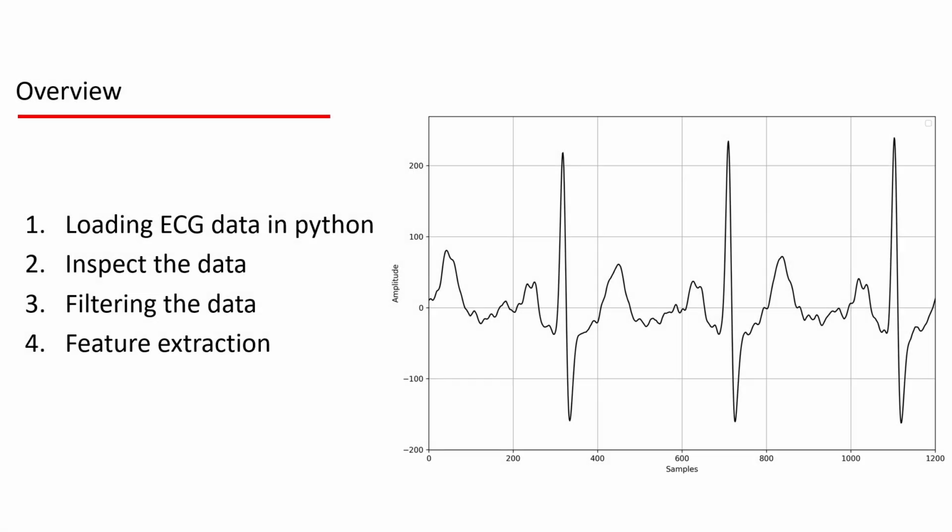Hey everyone, I've decided to create a short series of videos on ECG signal preprocessing in Python, because I feel like there aren't many resources on YouTube on this topic, so I kinda wanted to fill that gap myself. Over on the left, you can see an overview of the series.